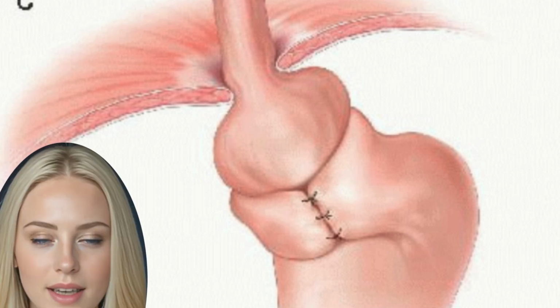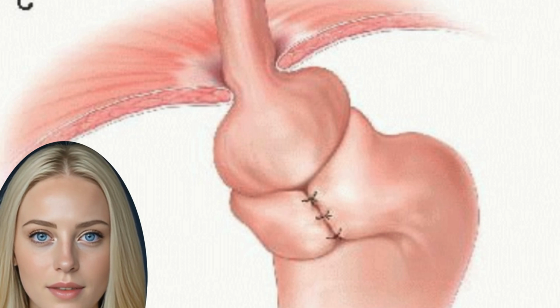Positioning: an operating table capable of steep reverse Trendelenburg position is required. Arms are tucked at the patient's sides but can be out 90 degrees and secured. Footboards on a split-leg table are mandatory, and a procedural reverse Trendelenburg test is used for safety confirmation of positioning.